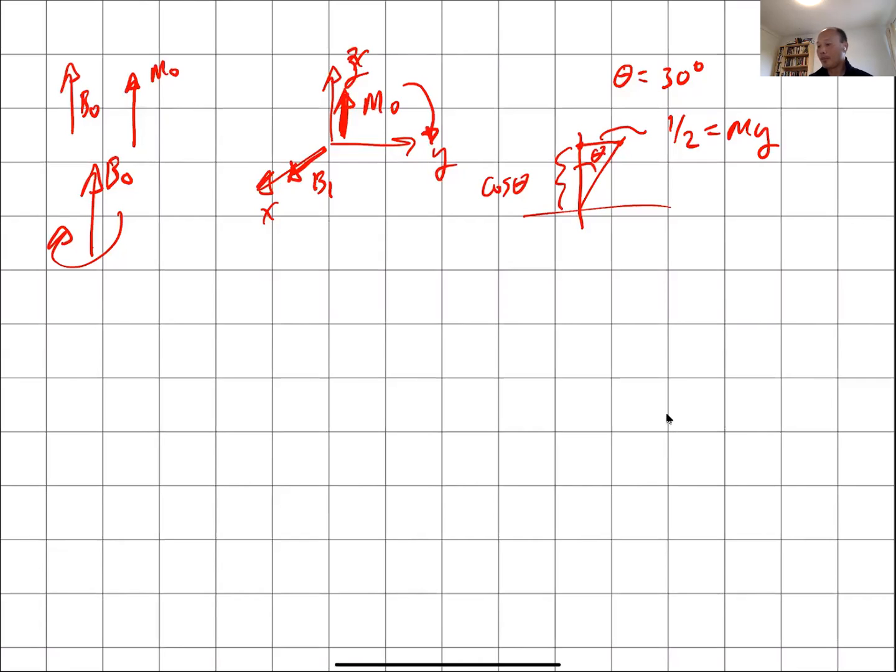So then we tip the magnetization away from the axis, right? And then it can spin around the axis. And so we said that the spins are going to precess, the Mxy component is going to be proportional to e to the minus j omega naught t. So that's going to be the precession of the transverse magnetization.